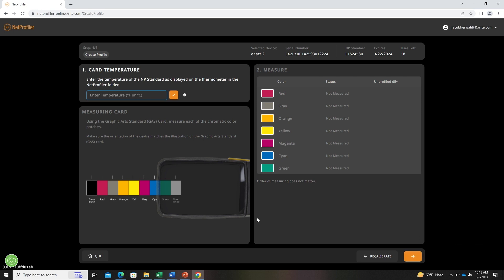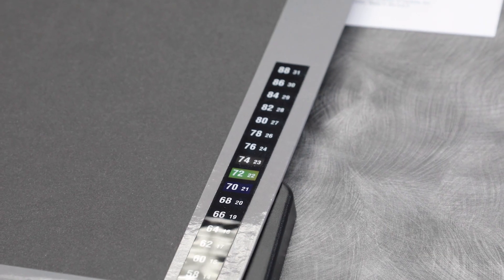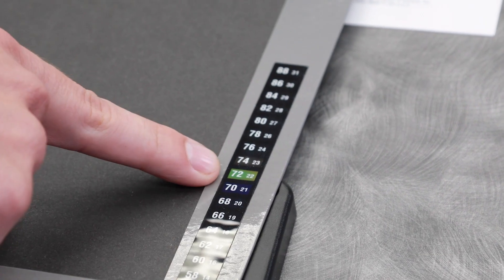Now we'll measure the color standards to generate the profile. First, we need to enter the temperature that is indicated on the thermometer in the folder located here.